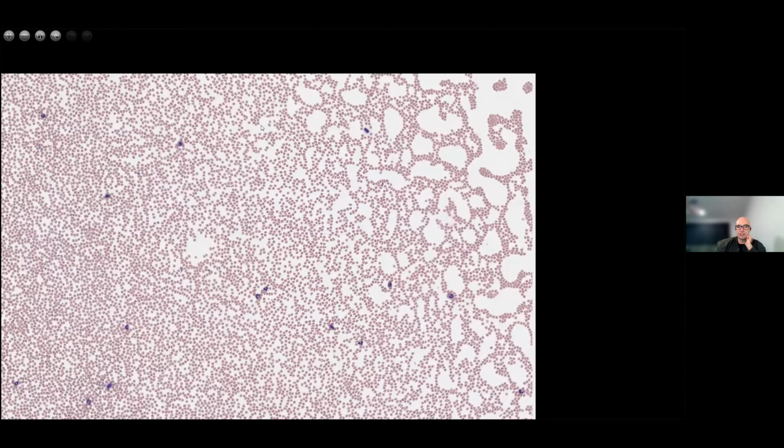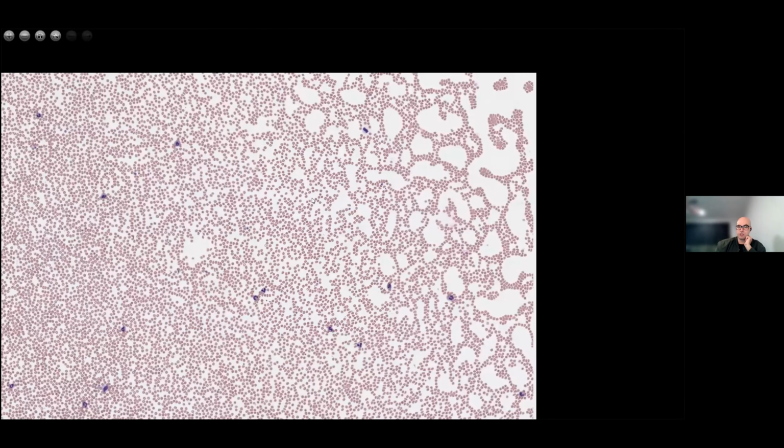No, so we can't really see any platelet clumping here. Also, looking on low power, you should be able to notice platelet satellitism if it was forming. That's when there is a similar autoantibody that only causes the platelets to adhere to the cell walls of white cells in the presence of EDTA or other anticoagulants.